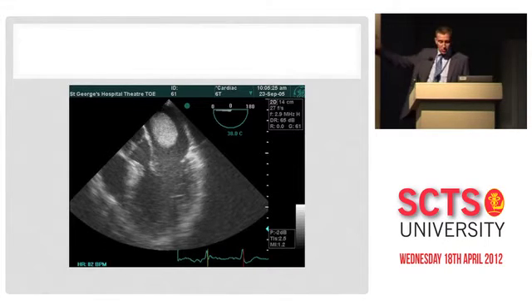And this, I can't show you this, but this had a smaller septal attachment and was much more mobile. When these tumours grow, they almost inevitably start to interact with the mitral valve and cause inflow problems, which is usually when people start to get symptoms, either that or occlusion of the pulmonary veins. I mean, as you know, these can grow for years and years without people noticing.